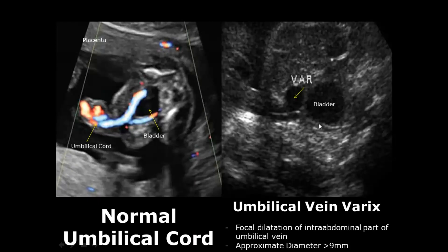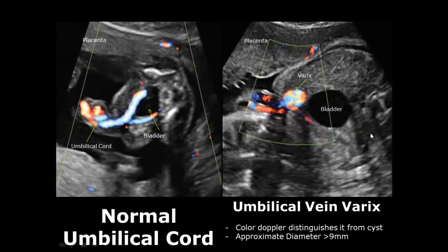Umbilical vein varix is a focal dilatation of the intra-abdominal part of the umbilical vein. We will see an anechoic structure near the bladder — this is the dilatation of the umbilical vein, and it usually measures around 9 mm in diameter. When we apply color Doppler, we can see internal flow, which allows us to distinguish it from a cyst.